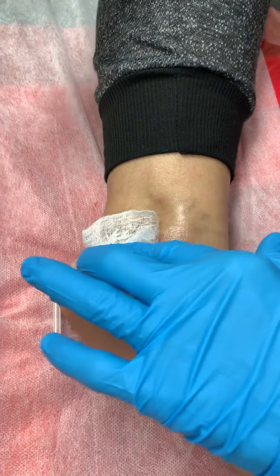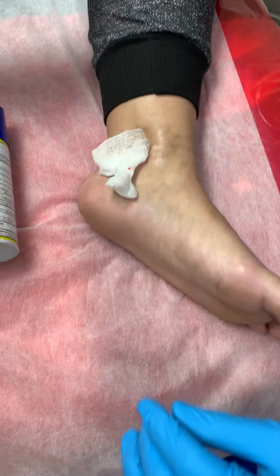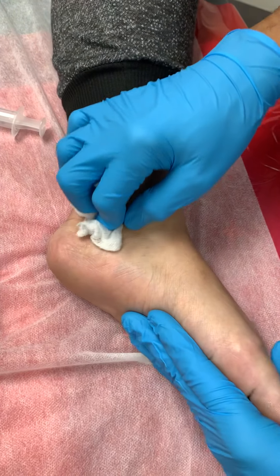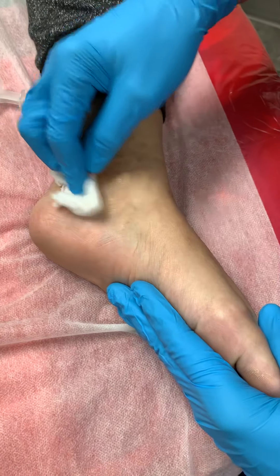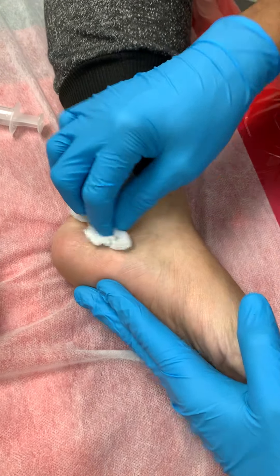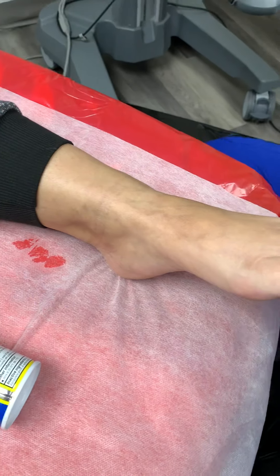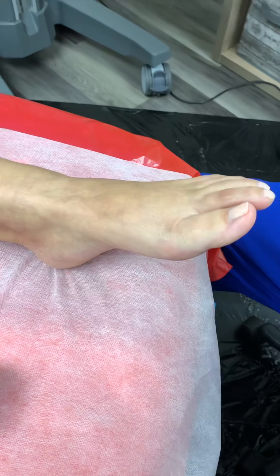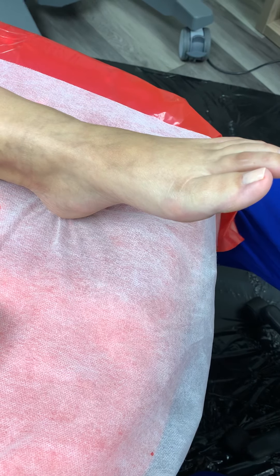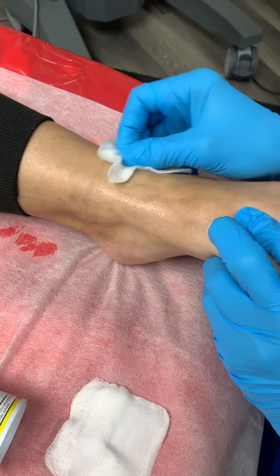Now cap that and give it a little massage like that. Dr. Nunez's left hand is on the foot because what happens is when the anesthesia touches the nerve and the neighboring artery, the anesthesia dilates the artery, which pushes more blood to the foot. So the foot becomes like an oven.